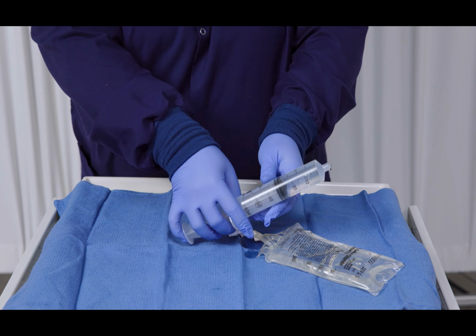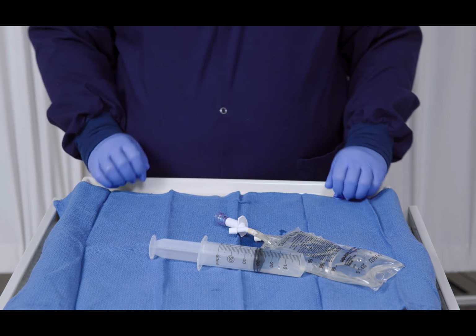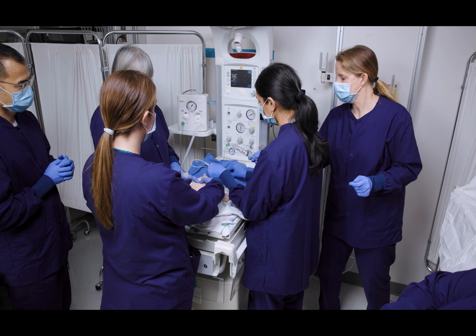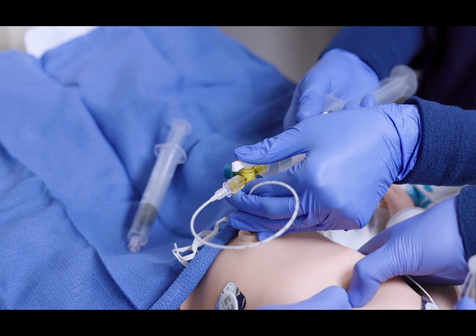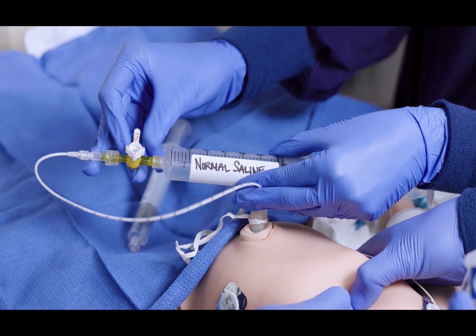These pre-filled syringes are usually not in a sterile package, but remember that you may make modifications to sterile technique for this emergency procedure. The medication nurse takes the volume expander to the bedside and confirms the order. Volume expander is infused over 5 to 10 minutes by slow, steady push, or use a syringe pump.